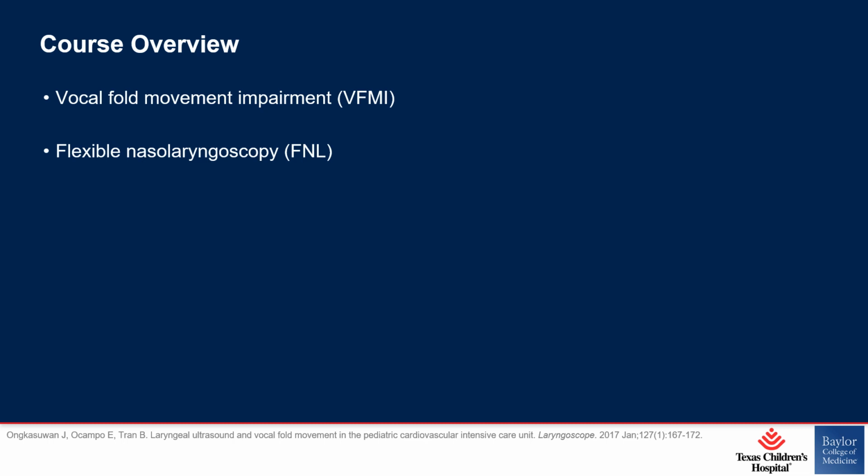In addition, awake flexible nasolaryngoscopy can cause significant changes in physiologic parameters such as blood pressure, pulse, and oxygenation, which can be particularly concerning in vulnerable populations such as children with congenital heart disease. Finally, the coughing and crying stimulated during the exam can be potentially aerosol generating.